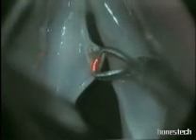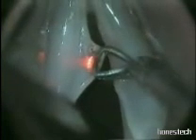The dissection is carefully done away from the vocal ligament. After resection, the area is cleaned with a pledget soaked with saline solution and adrenaline at 5 degrees Celsius. As already observed with the micropoint, no thermal damage affected Reinke's space during phonomicrosurgery.